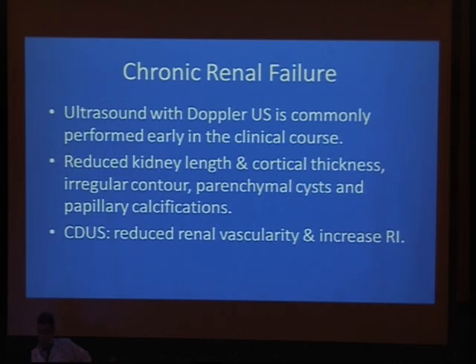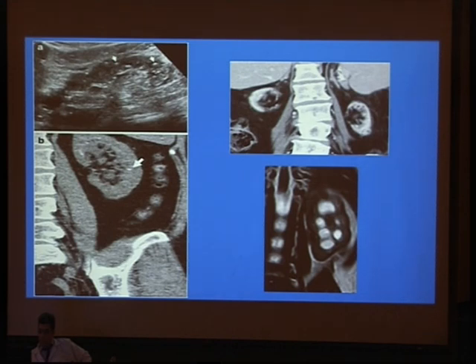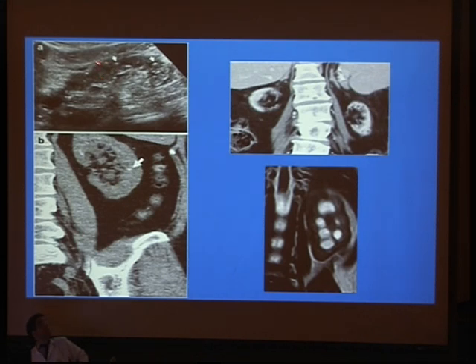On Doppler ultrasound, if there is reduced vascularity and increased resistance, it will be highly suggestive of chronic renal failure. This ultrasound shows increased echogenicity, irregular contour, and loss of corticomedullary differentiation with reduction of cortical thickness. This is also a case of papillary calcification — a case of chronic renal disease at ultrasound.